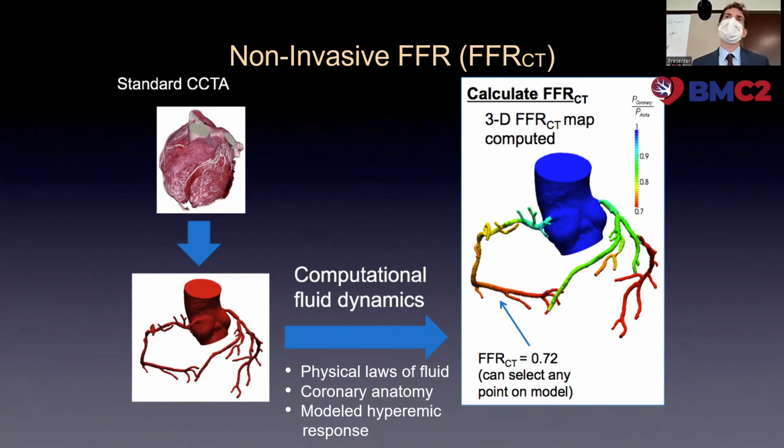And there's a lot more complexity than whether it's 50% stenosis or 70%, which is sort of an eyeball estimate. There are a lot of subtle things: is it a long lesion? Is it a short lesion? Is it before an artery branches or after a branch point? They can affect whether it's significant or not. So they attempt to do a lot of modeling looking at that.